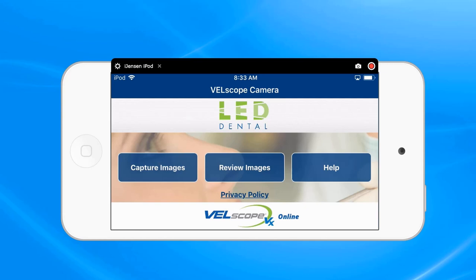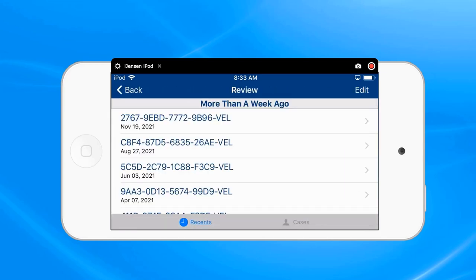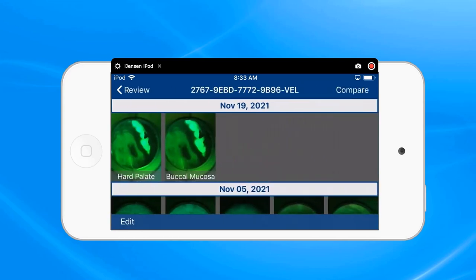Assuming we've already taken that picture and now we want to transfer it, we're going to go into Review Images. We're then going to identify the patient by the code that hopefully we transcribed or put into the patient's chart previously, and then highlight that patient. We then have all the images available under that patient's code, and at that point determine which images we want to transfer.